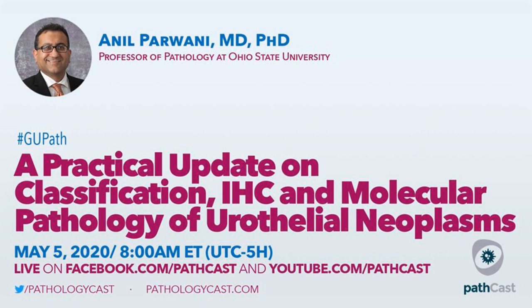The next question is, for micropapillary urothelial carcinoma, is HER2 stain done on immuno or FISH? On immuno, do you just say positive or negative, or do you do a scoring? For HER2 neu on immunos, we follow the same process as we do for breast cancer. If it's unequivocal, we report it out. If it's equivocal, we defer to FISH testing, and we report the FISH results.